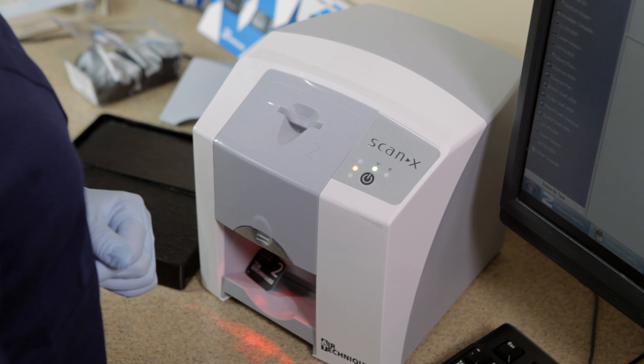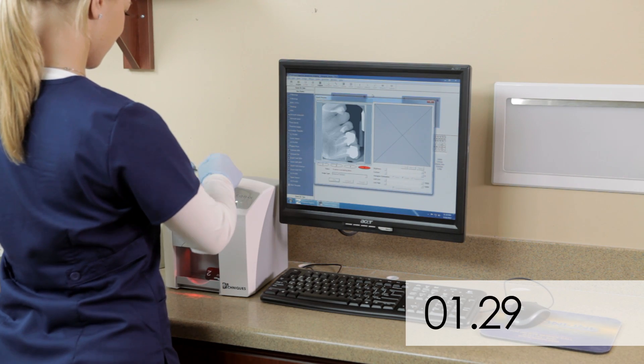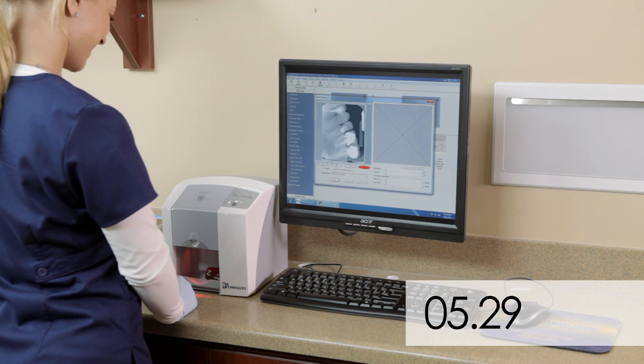Tear the envelope open, starting with the bottom notch, while lowering the sensor into the inlet guide. Press the sensor down until the unit grasps it and moves the sensor on its own.